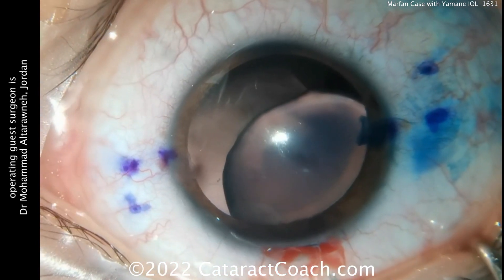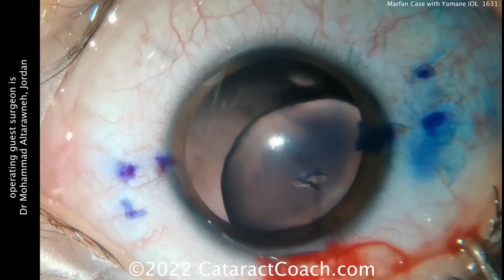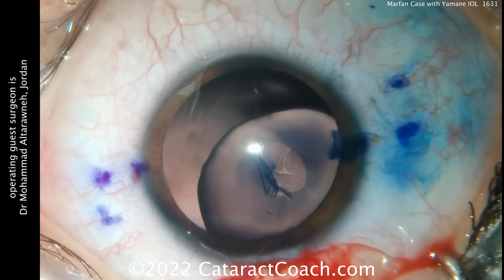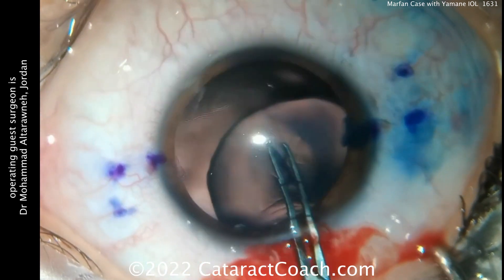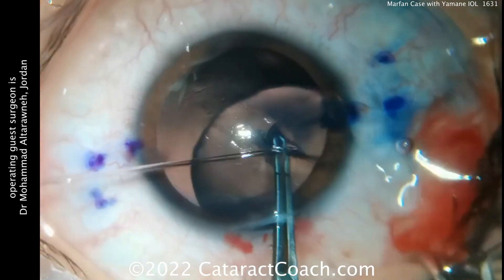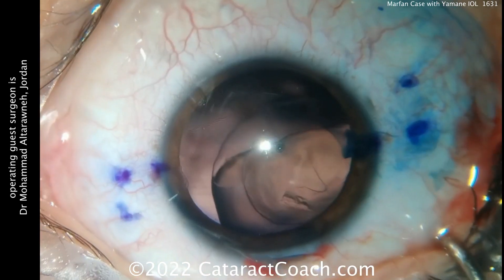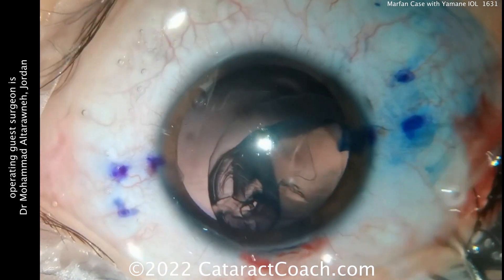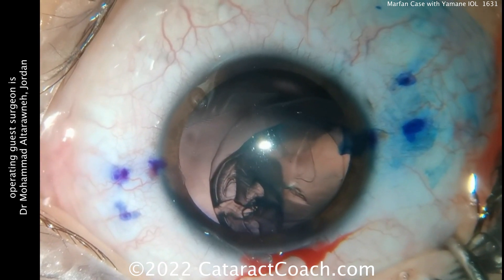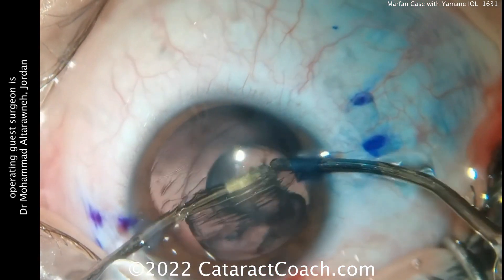What's your option for removing this lens? The whole lens is going to be removed. Could you save the capsular bag? You could, but then you'd have to fixate it on either side — put a CTR in and then put in two capsular tension segments, one 180 degrees opposite from the other, and sew those in place. But here, a nice capsulorhexis is done, separating the lens material from the capsule. You don't even need a phaco probe — this is going to be pretty soft. Just put in your irrigation-aspiration probes; a bimanual set will vacuum the material right out of the capsular bag.